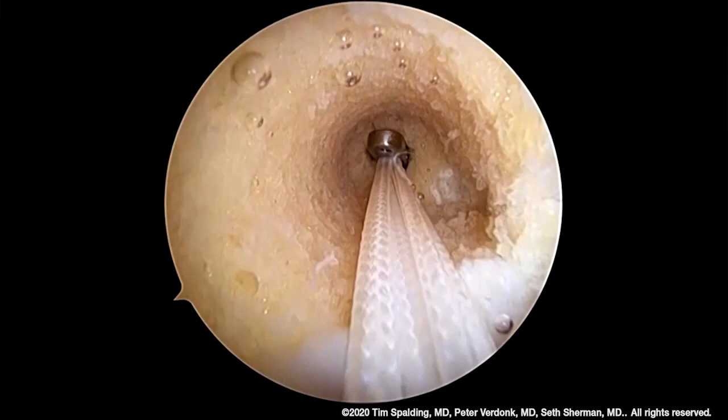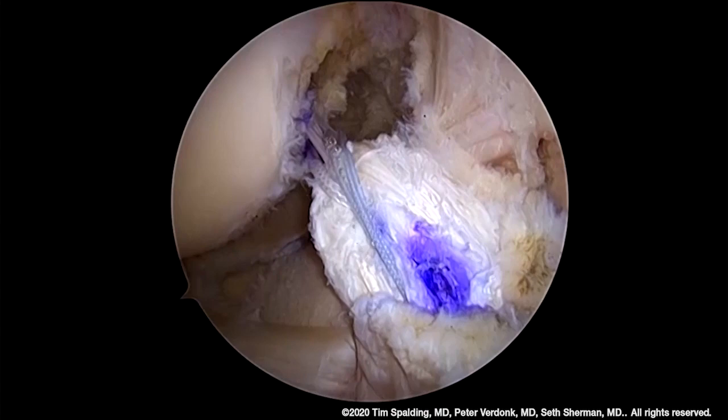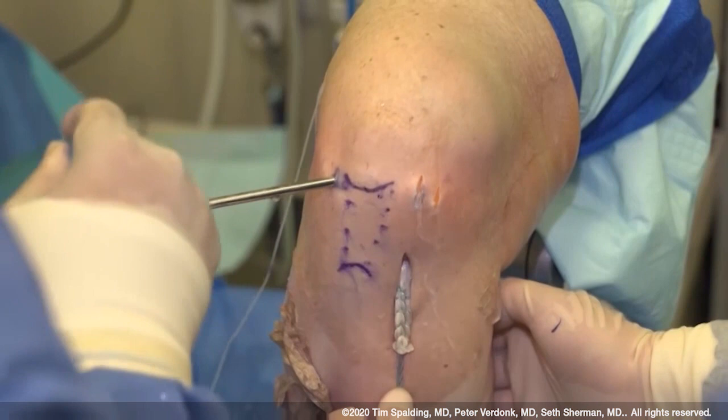Slack should be taken up within the white strands. We can visualize through the medial portal seeing the button go past the lateral cortex. Once this occurs, gentle back pressure will allow flipping of the button. Once the button is secure, the white strand with the blue tip is the only one utilized to bring the femoral graft into the socket. If the graft is brought too far up into the femur, there is an option for the reversibility tab — pulling back on it allows the graft to come back from the femoral tunnel for fine readjustment of tension.